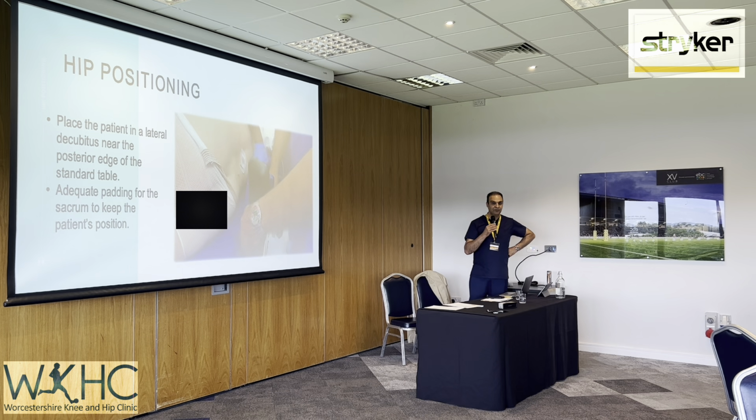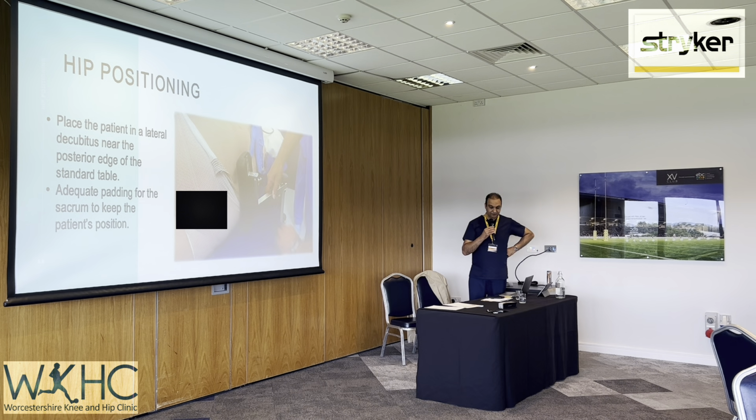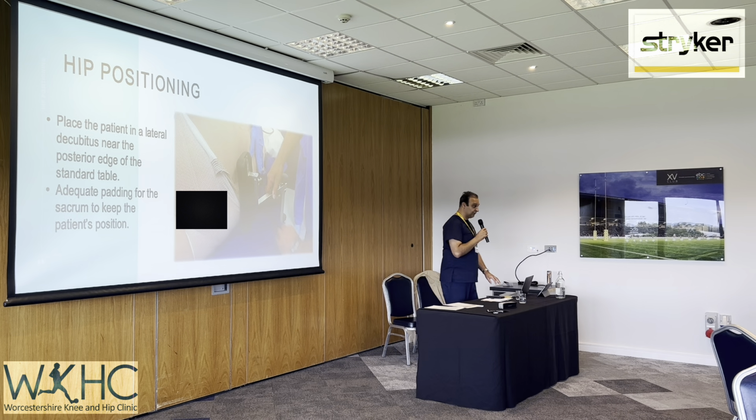You don't want to have props which are sticking out, because when you do a hip, the robot comes from the opposite side. When you do a knee, the robot comes from the same side. So we started off with those props that stick out. We found that they would block the robot, so we wouldn't recommend those.